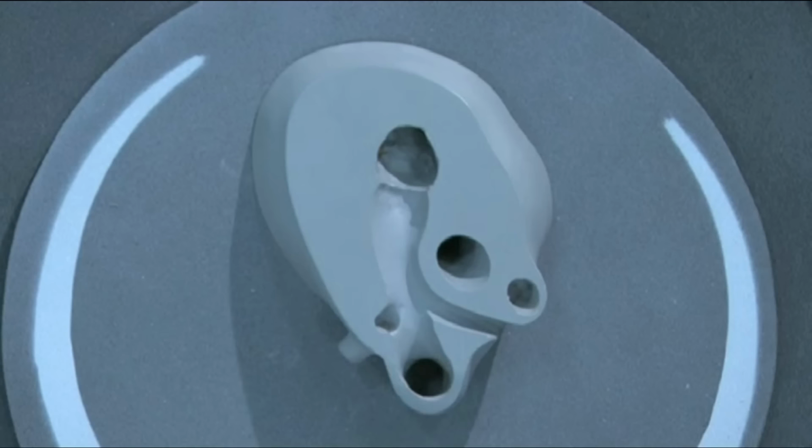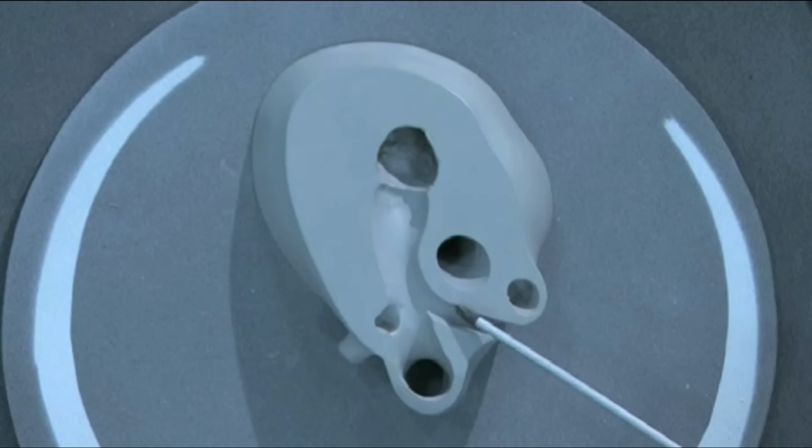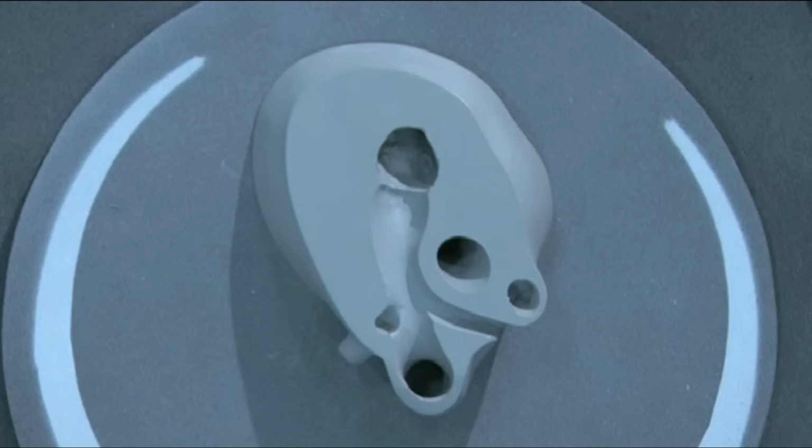And in this situation, it shows up very clearly, partly because it's perpendicular and partly because it's on the other side of the ascending aorta, which means there's a rapid change in densities which allow for the walls of the right branch to look quite marked and obvious on the scan. In fact, sometimes it can look almost as bright and as large as the aorta in this view.